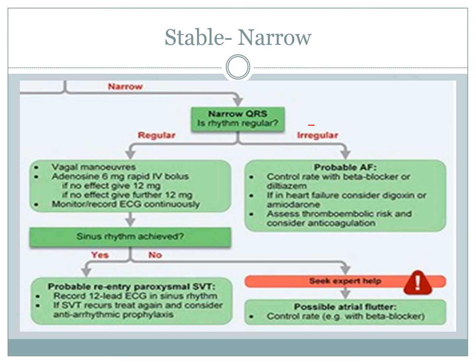When you move into your irregular, okay, so obviously irregularities have a little bit more, I don't want to say danger, but they're more likely to have less output associated with them. So then we need to look at the probability of AF, because that's what we considered before with the broad QRS, it's moved over to here. So with AF, we need to know how long AF has been in place.